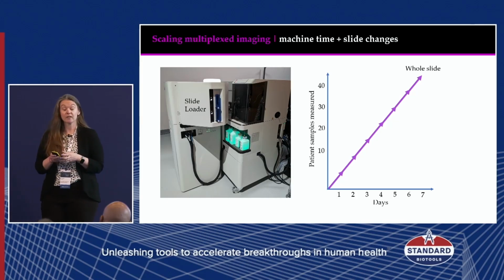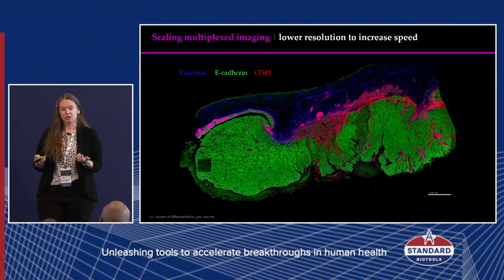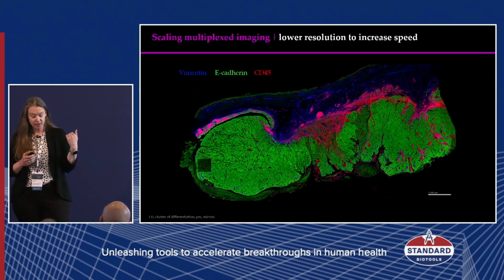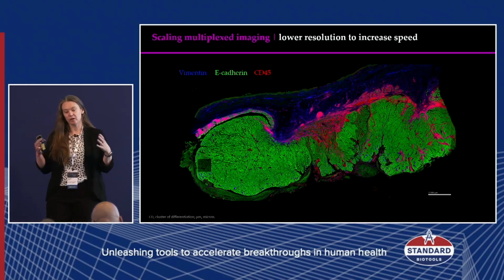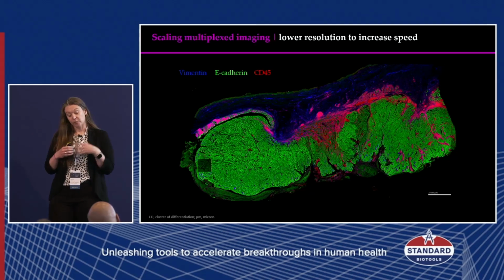Or on a Saturday when you'd rather be somewhere else. And so what does this look like? Now, we saw this image in the video. I have to tell you that this was our largest piece of tissue. We put together a small panel and stained it and sent it to Standard BioTools for acquisition. I wanted to make sure the staining looked good, and so I pre-ablated a small ROI at 1 micron just to make sure everything looked good.